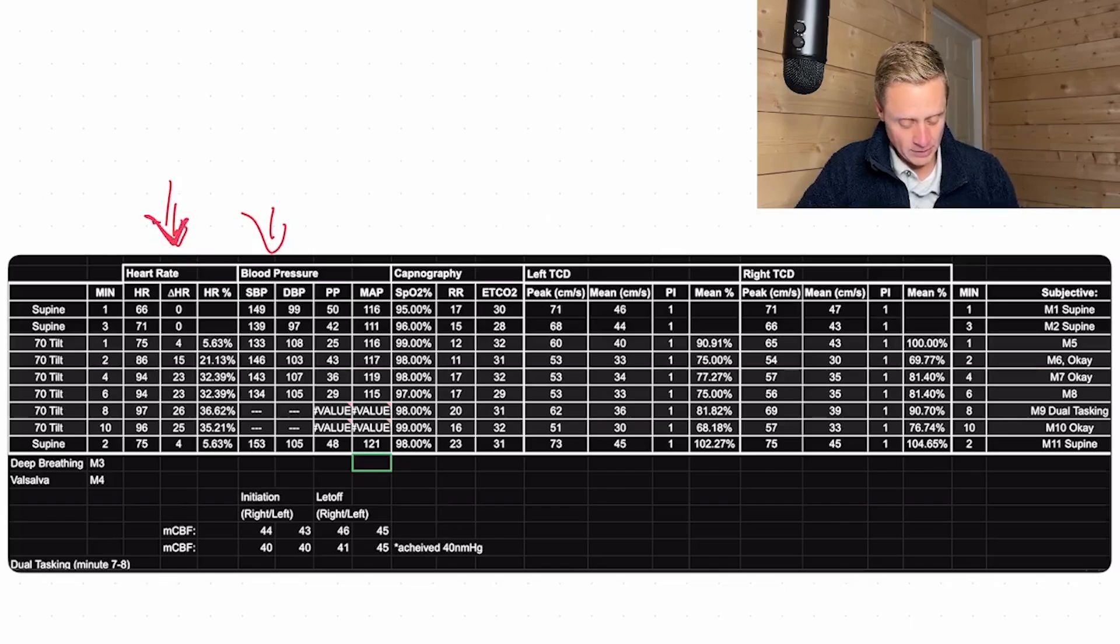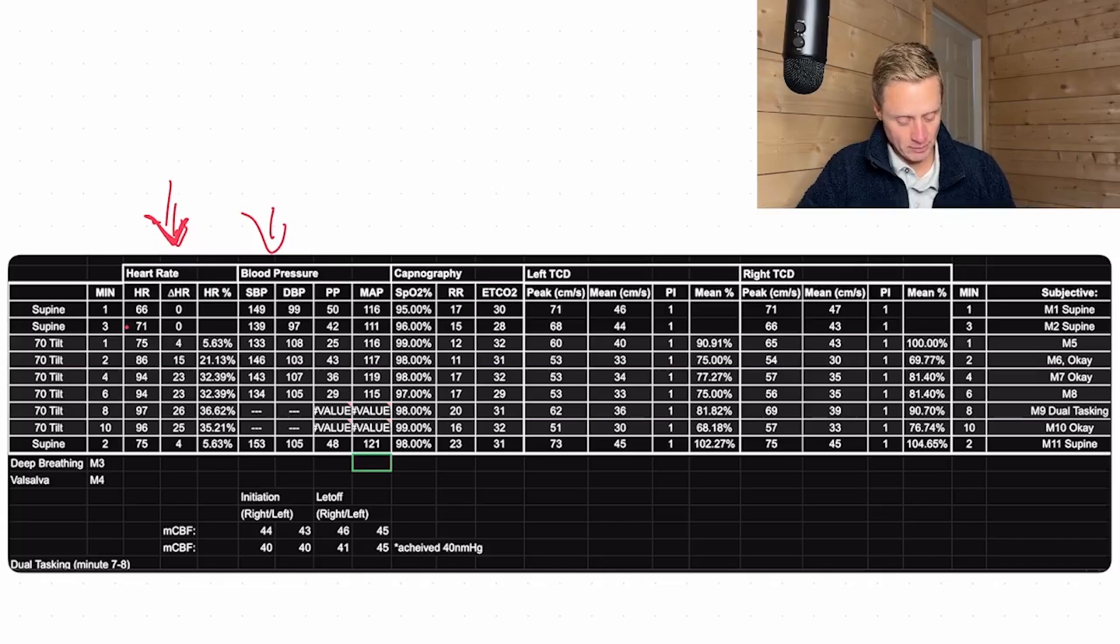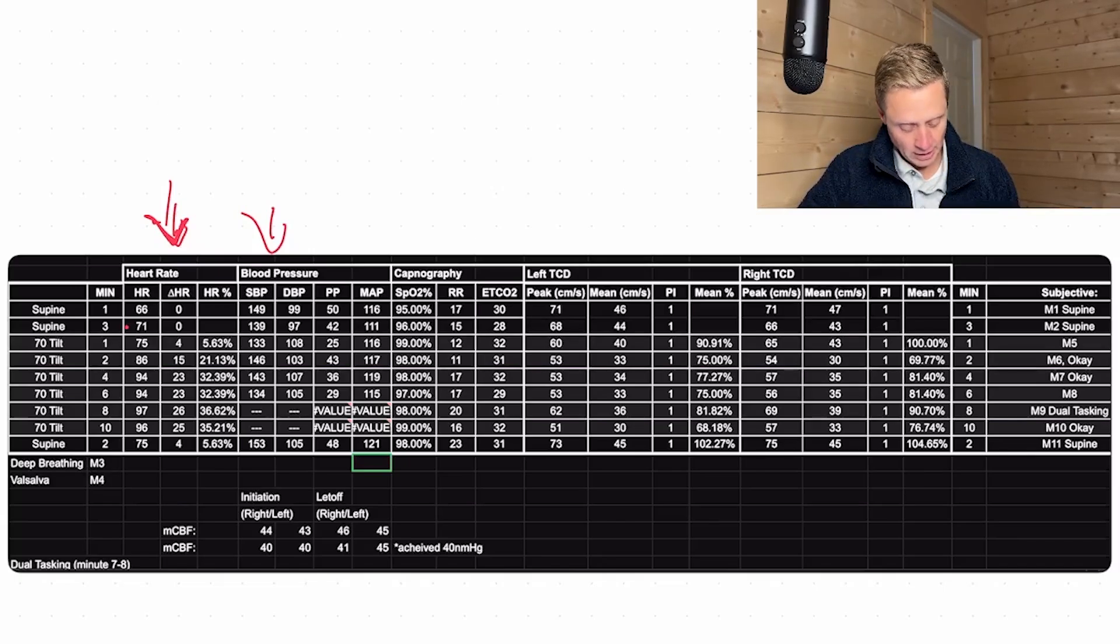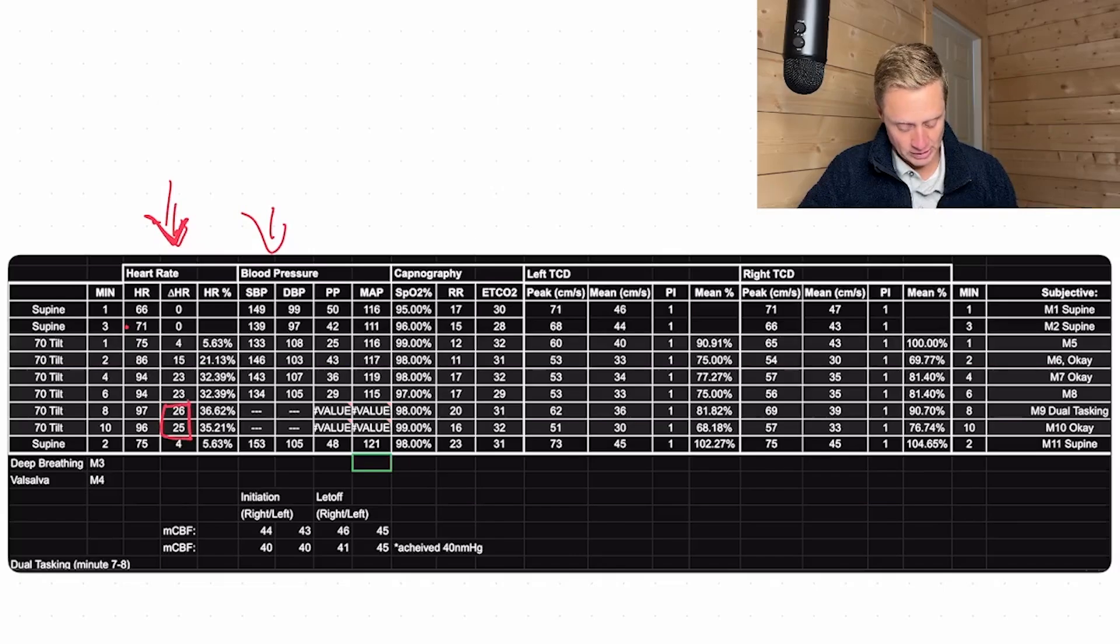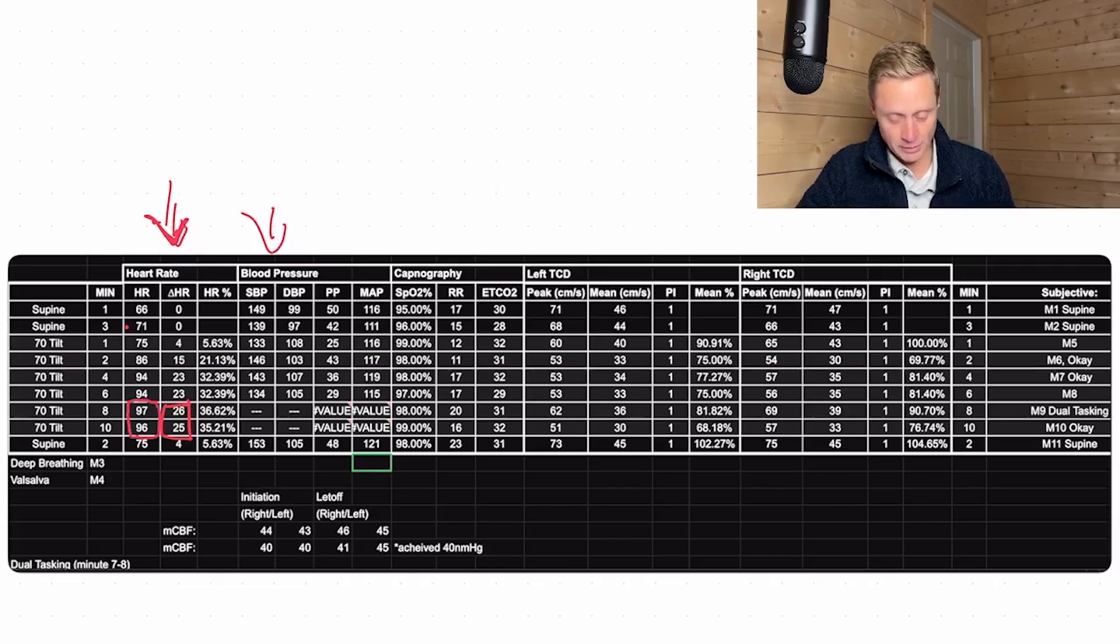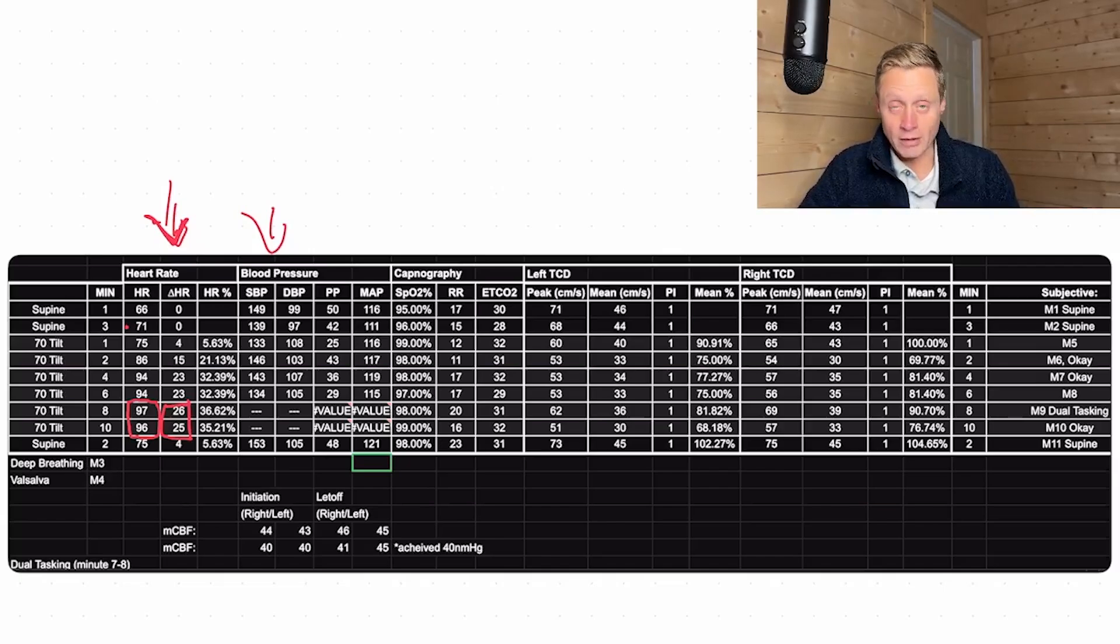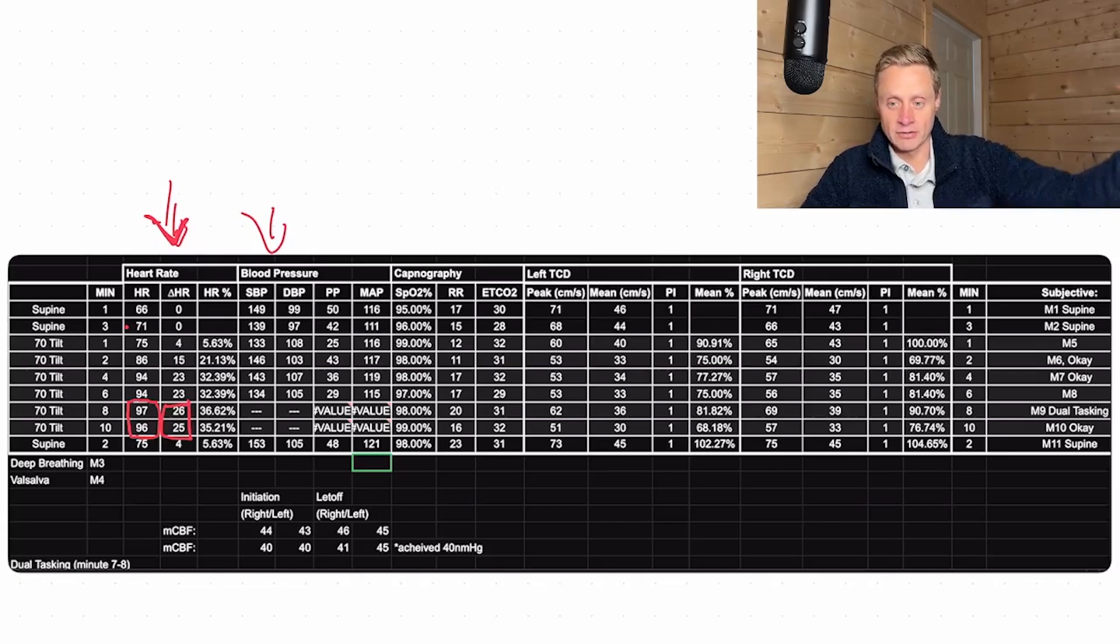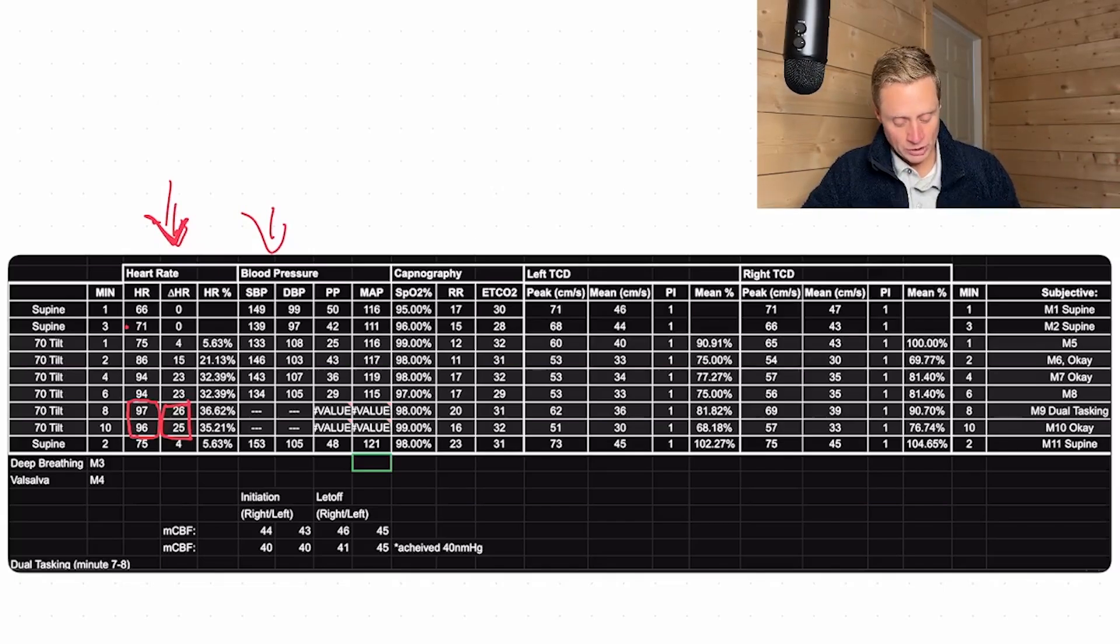If you look here, we start off at a baseline supine level of about 71 beats per minute, totally normal range, and then it climbs up a little bit. We get a delta, the highest delta is around 25 or 26 beats per minute, so that means the heart rate climbed up to 97, 96 beats per minute. Which, by technical standards, doesn't really qualify as pathology, doesn't really put you in a POTS category. Heart rate's not high enough to be put into an inappropriate sinus tachycardia.